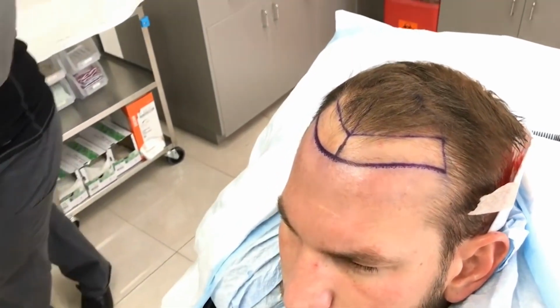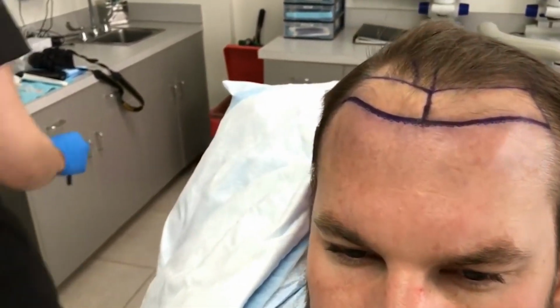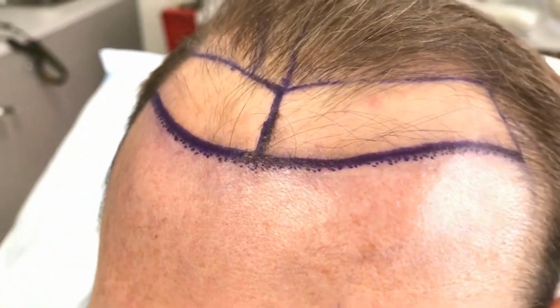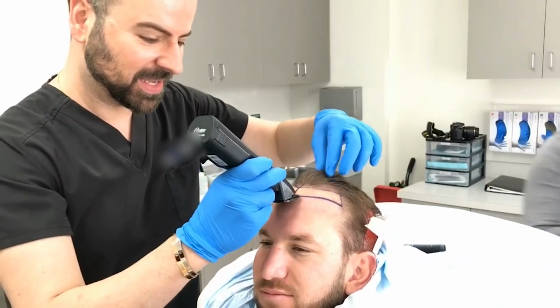Let me take a look. Awesome. All right. So now we're going to clip. Can you take some photos? Oh, sure. We're going to clip the rest of the hairs, Chad, okay? Ready? Apologies about this.